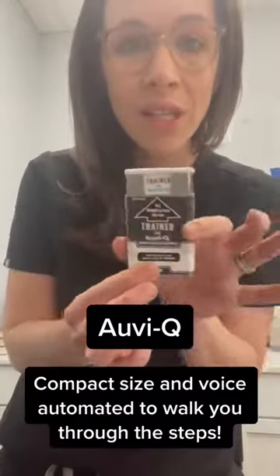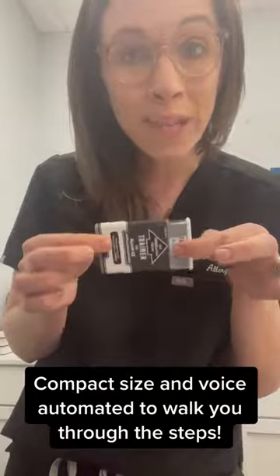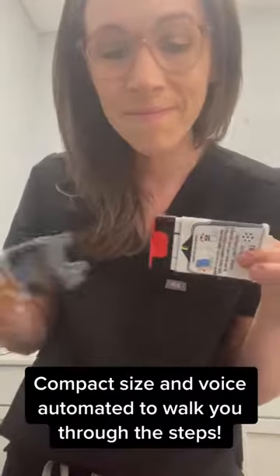There are two different devices that we have access to that contain epinephrine. One of them is called AviQ. It looks like this — it's a really nice compact size. There's also a voice that talks to you. Should you need to use this medication, you can listen to the instructions, you can read the instructions here, or you can just go ahead and do it on your own.